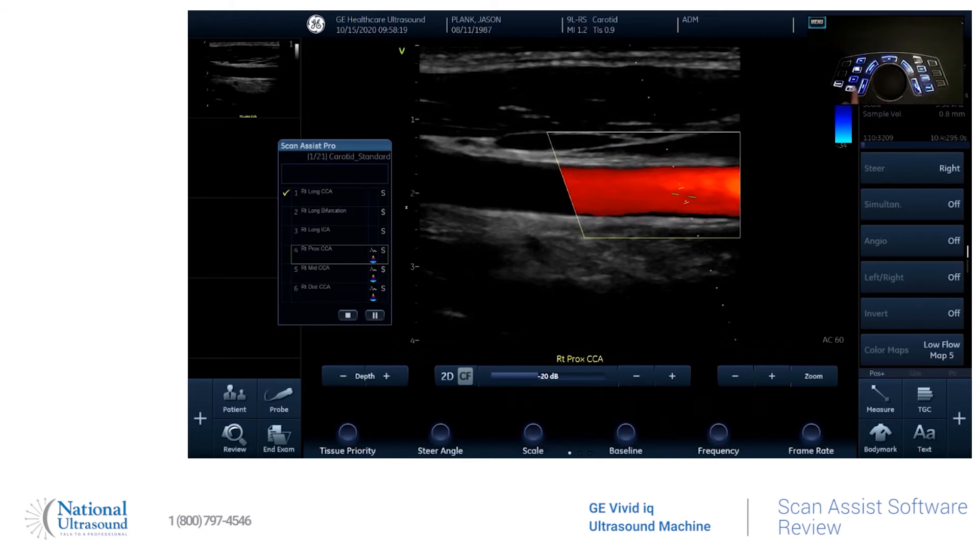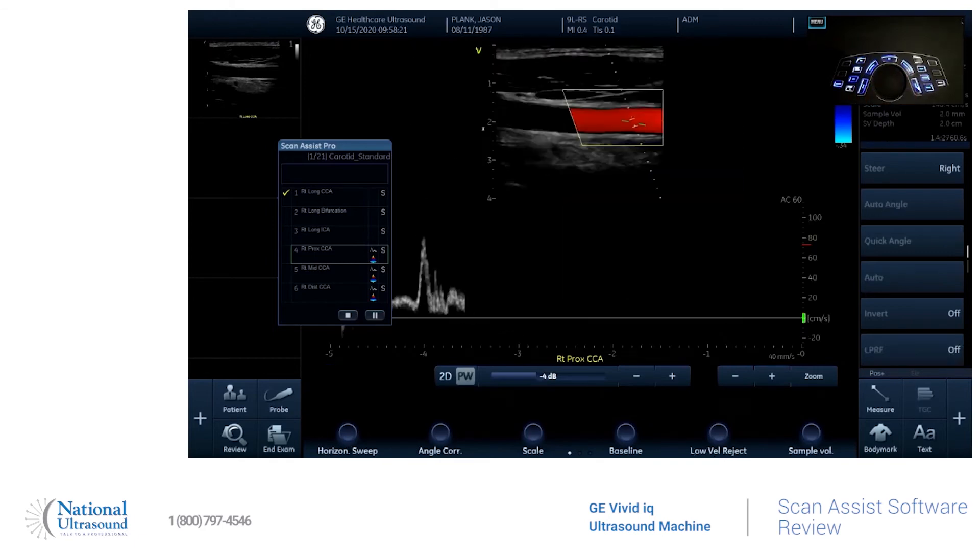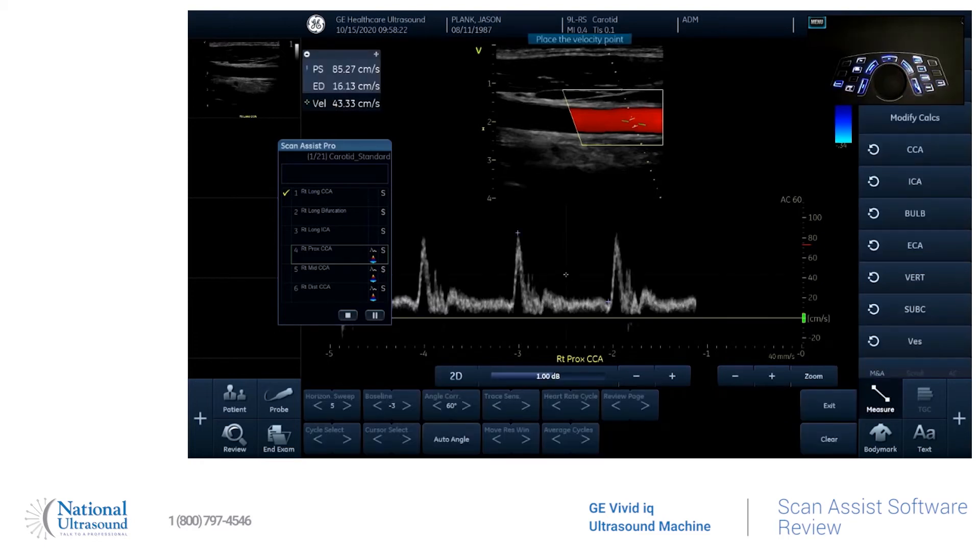You'll hit update, and it'll bring your velocity — hit freeze. And the calculations are automatically going to come up as well. So it automatically did that. If you wanted to erase that, you can hit clear and do it on your own. If not, just move it off the screen.